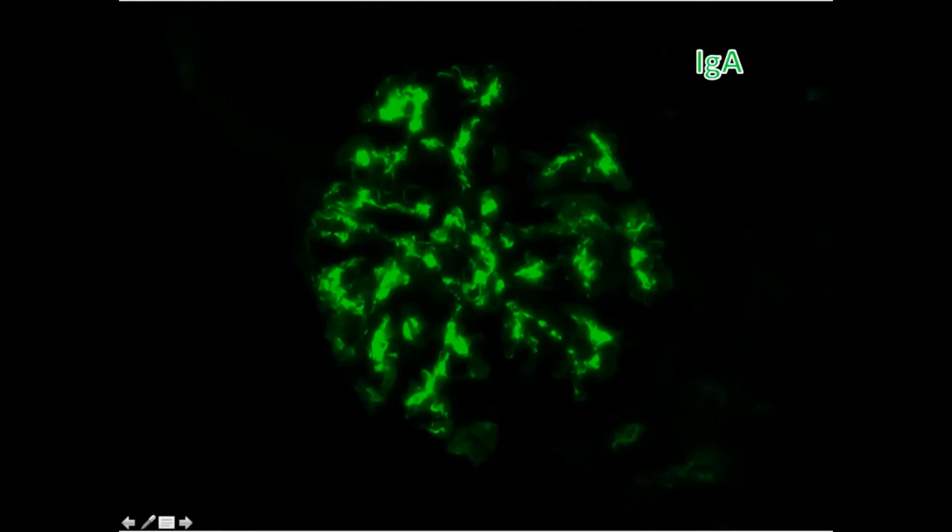Okay, كأن زي ما قلت لكم كأن it is the أفرع مالت الشجرة, sorry, the trunk, أفرع, the trunk of الشجرة وقلب الشجرة لما تشدي تتوزع. إنزين, it is هي في الأفرع. And not في أوراق الشجرة. Okay, this is كلها في أفرع الشجرة, كأن الشجرة ما فيها أوراق. So this is mesangial. Okay, and this is in IgA and lambda. Everything else is negative.